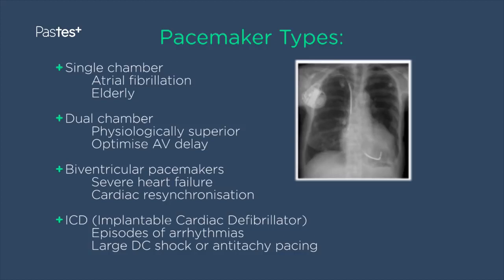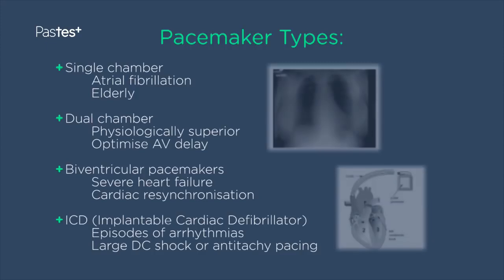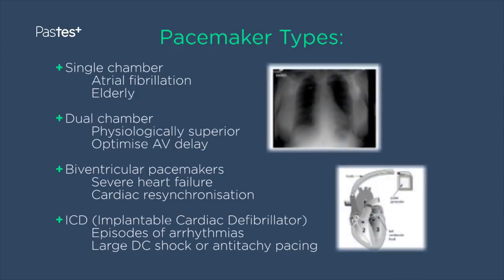When these pacemakers were introduced, it was a huge advance, and patients who have these pacemakers implanted instead of single chamber pacemakers often describe marked reduction in symptoms of breathlessness, which can often accompany a single chamber ventricular pacing lead only. The third pacemaker, which we implant for more specialist indications, are biventricular pacemakers.